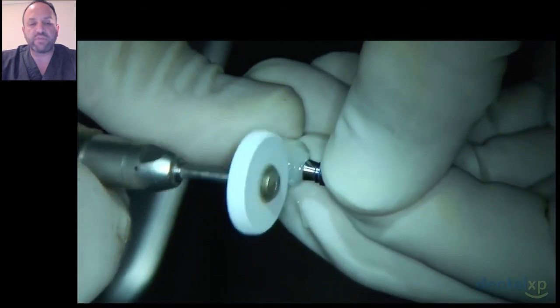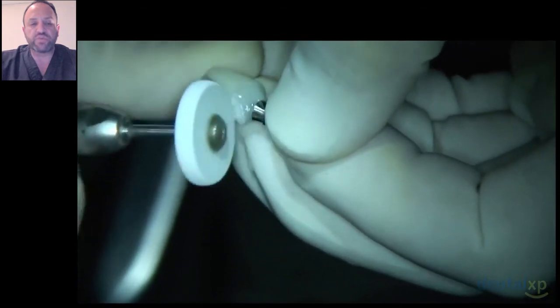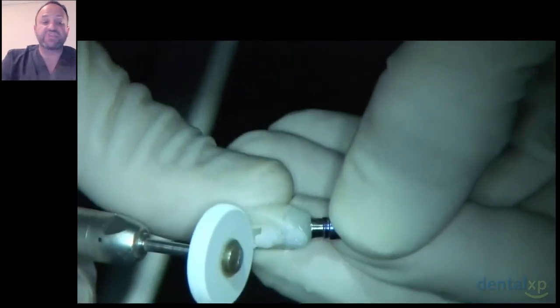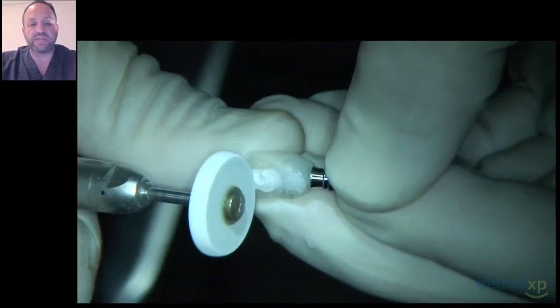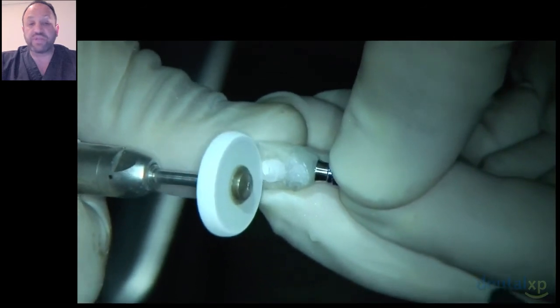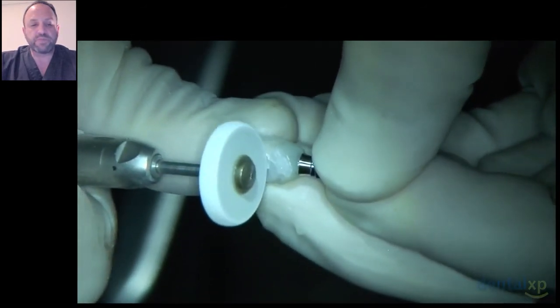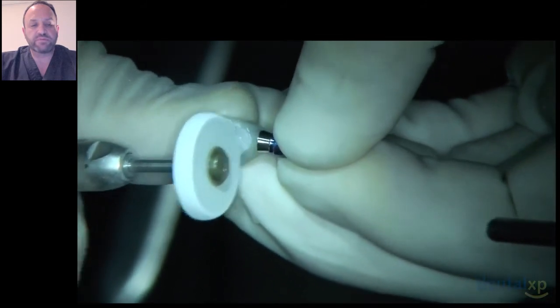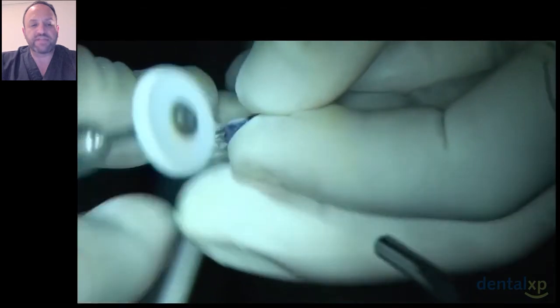And here you can see the rubber wheel that we use to start shaping the soft tissue portion, the subgingival portion. Very important to create that S shape to allow soft tissue to remove the excess bulk on the palatal side and to make sure that there's going to be no occlusion on this crown. So here you can see very much getting everything into nice shape, and going over to the palatal side and creating that S shape.